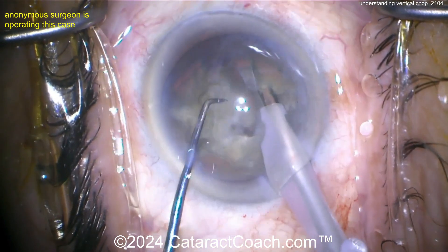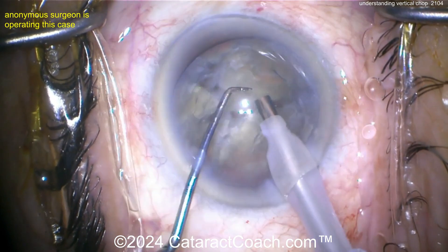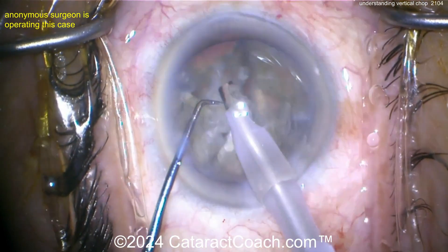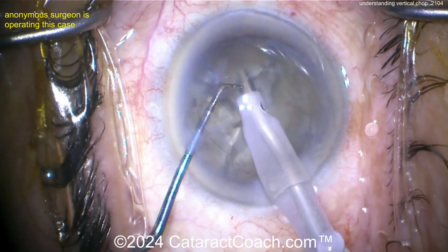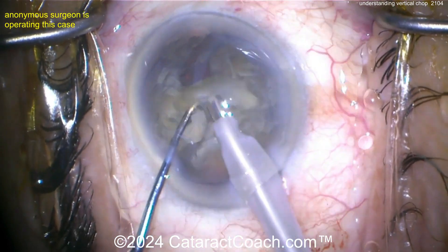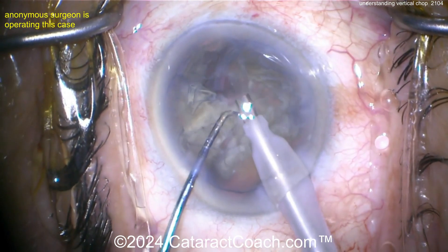You push the chopper into the nucleus and then pull the chopper and phaco probe apart to propagate the chop — that's vertical chop. In contrast, with horizontal chop the initial path of the chopper is parallel to the iris. Here, the initial path of the chopper is poking downward towards the optic nerve into the middle of the nucleus — that's a vertical position, which is why this is called vertical chop.